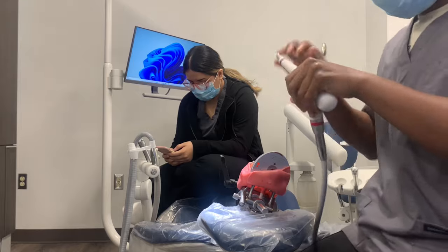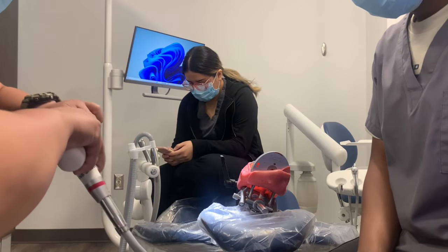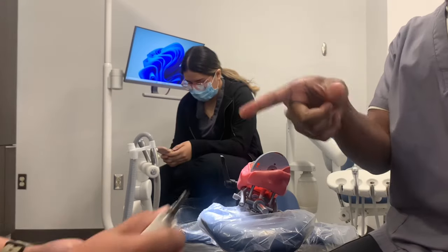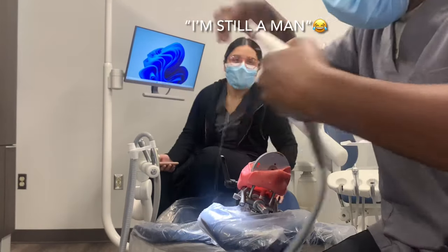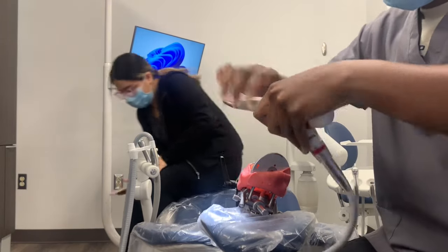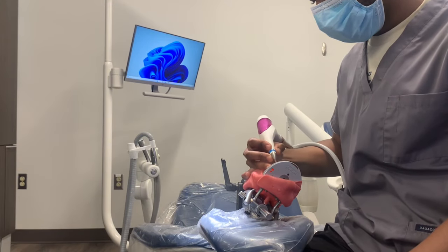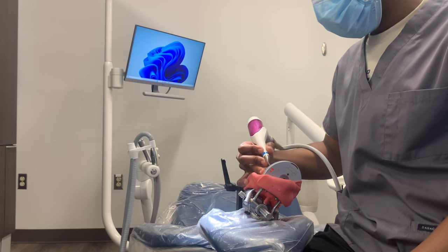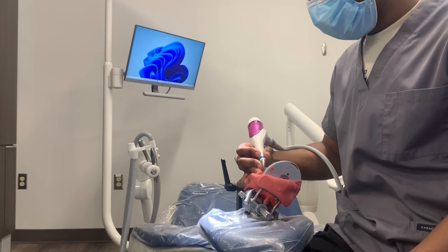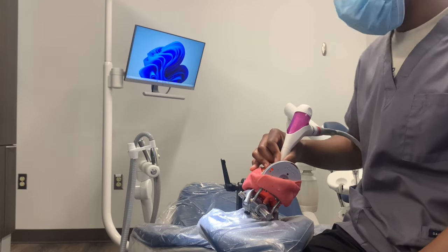And then look what happens — I hand it over to Jasmine and look what she does. Oh my God, you have got to listen to my reaction. I finally switched over to the supergingival tip — it's almost like a metal tip and the water and powder solution come out of it. You hold it three to five millimeters away from the tooth, angled down towards the crown of the tooth. You never want it angled towards the gum line. It is great for removing plaque and biofilm.